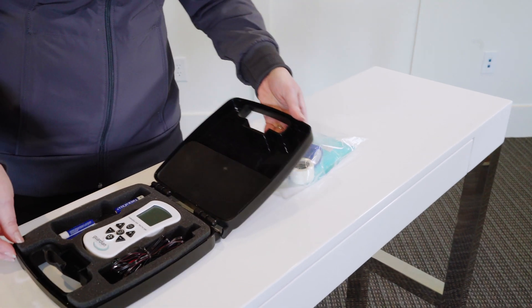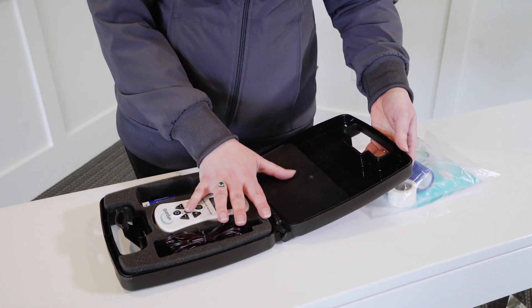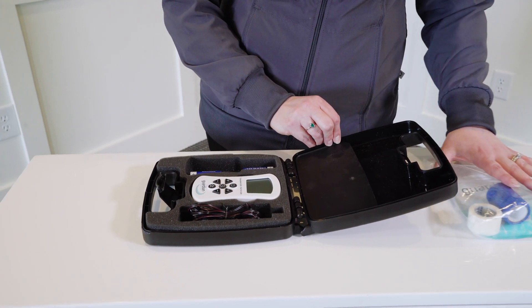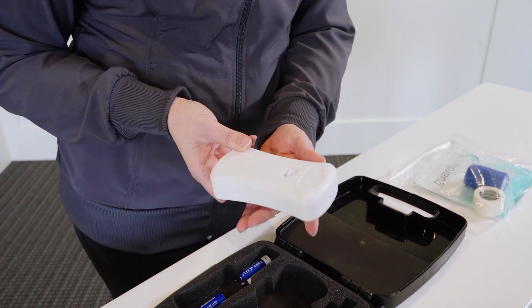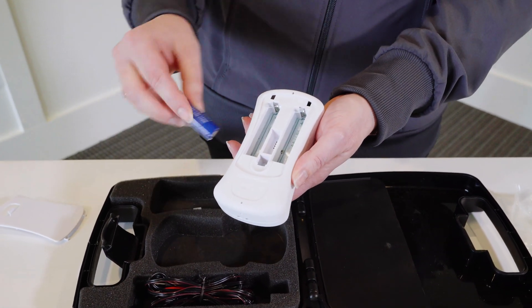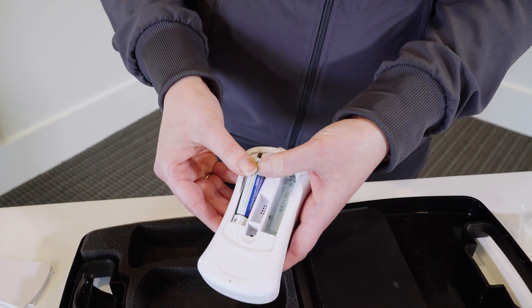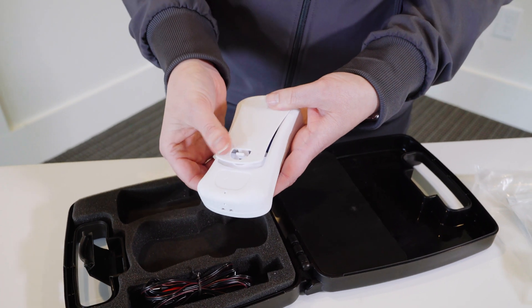It's going to arrive with a black, hard plastic carrying case — this is what you'll store the device in — and you'll have a separate bag with some accessories that we'll cover in a moment. The first thing you'll do once you take it out of the package is open up the battery compartment and insert the four double-A batteries. Just follow the diagram and keep that plastic in place so it'll be easy to change the batteries in the future.